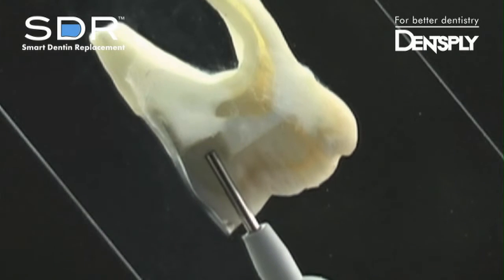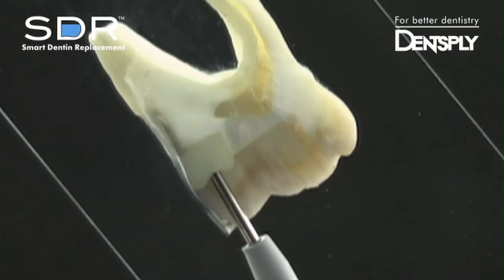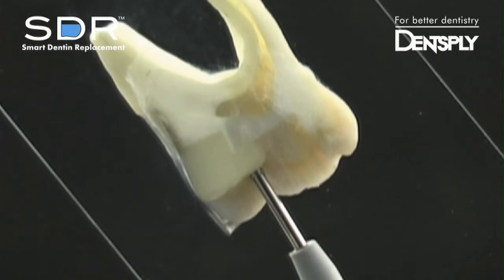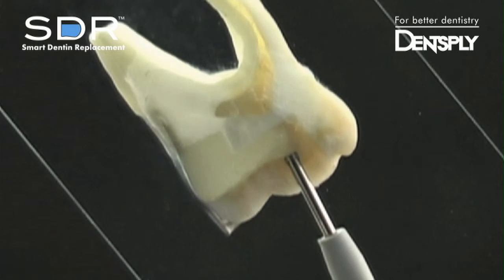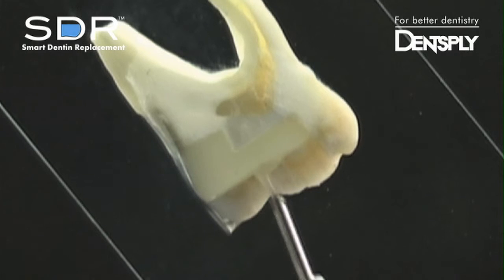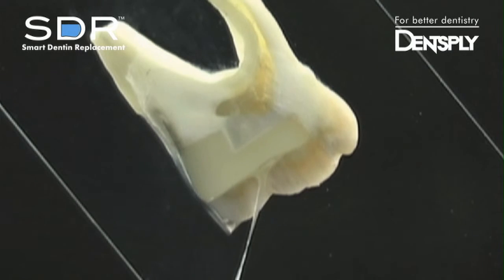Begin dispensing at the deepest part of the proximal box and watch as SDR self-levels and adapts to the corners of the prep. After dispensing up to 4 mm, SDR remains where placed and does not slump or flow out of the cavity preparation, making it ideal for use in maxillary posterior restorations.